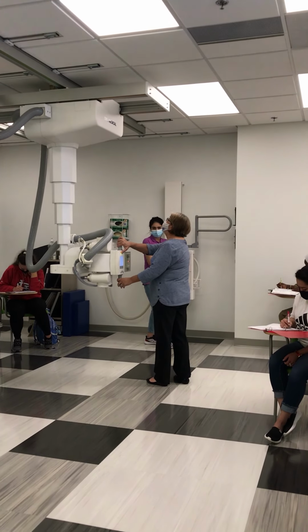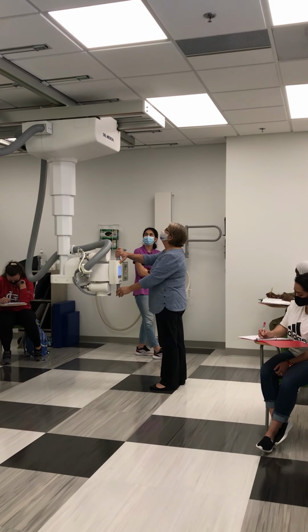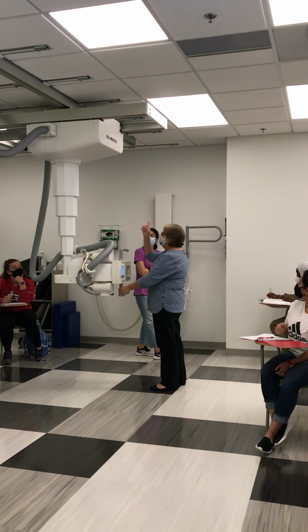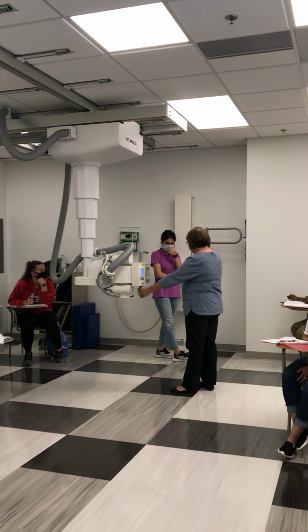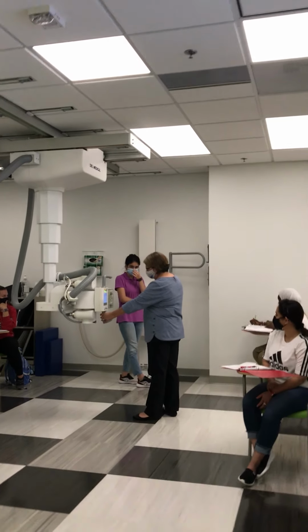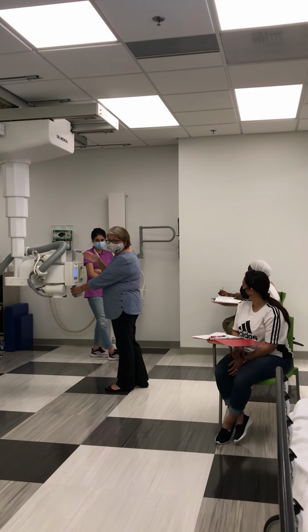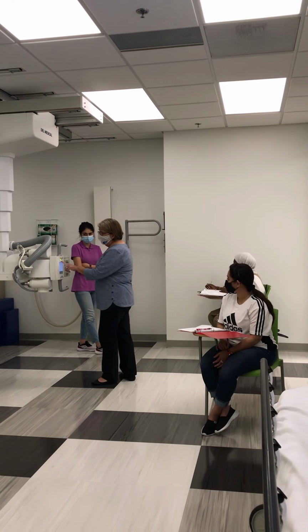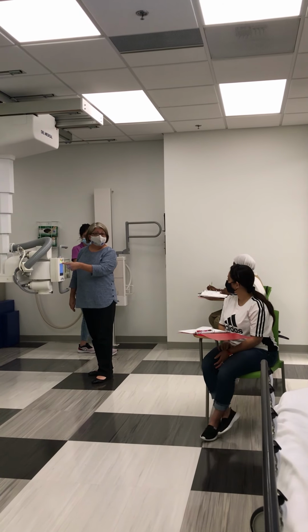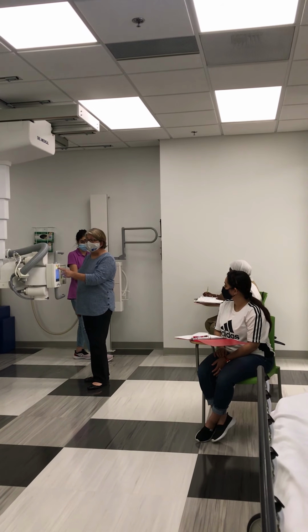So I'm going to move this tube closer, and I'm looking along the green track, and I have this tube locked in so that it's 72 inches from the wall bucky. That's your source, meaning your X-ray tube, to image receptor distance. I know that this is in detent because I have the light that's on next to the green button.